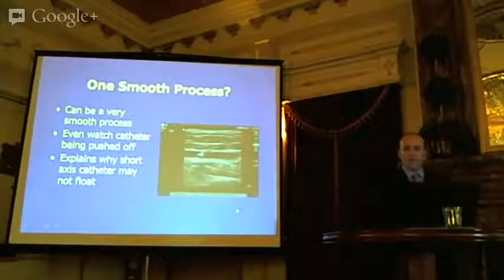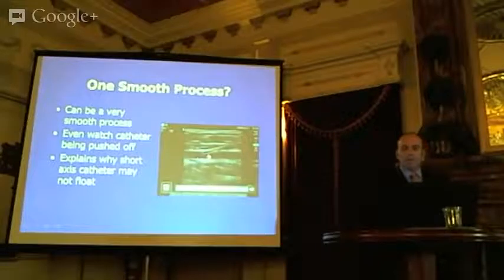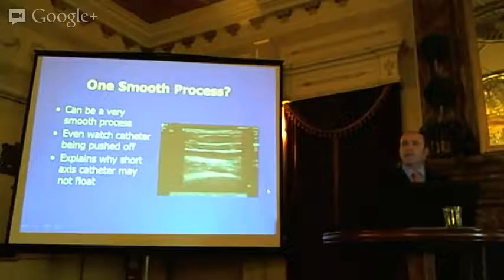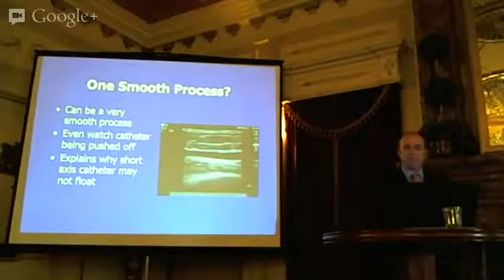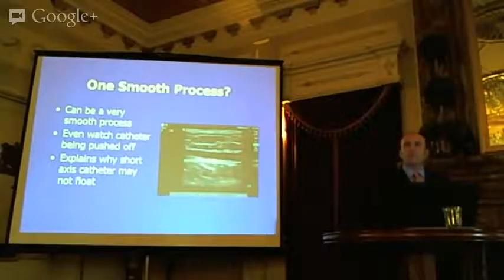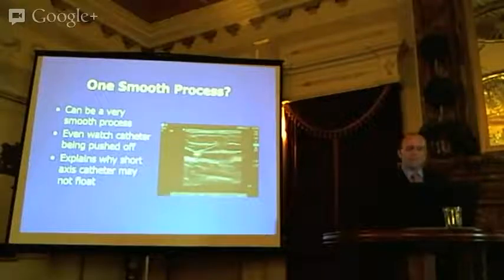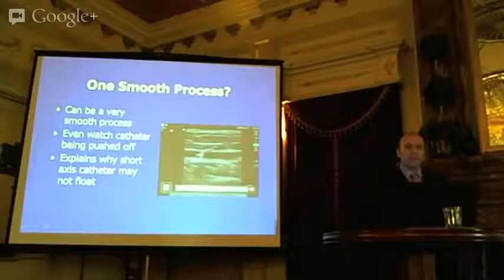And we talk about, well, if you push it in way up there, and the needle hub was almost at the top wall, the catheter would go in. So, but now, you push the catheter off, you can see that it's actually in. You can avoid many failures. You don't have to go to another site. You don't have to blow a vessel. And for those of you that are putting these in so you can get a contrast injection for a CT angiogram, you know what happens when the line works loose and they've got a big, huge arm. It's just an accident. So this is a very slick way to do lines, even though it is a little bit more challenging.